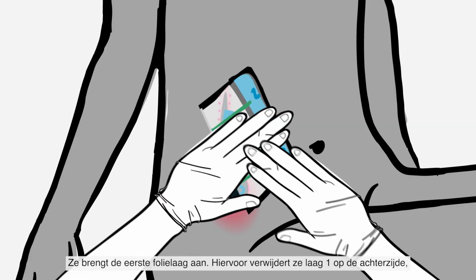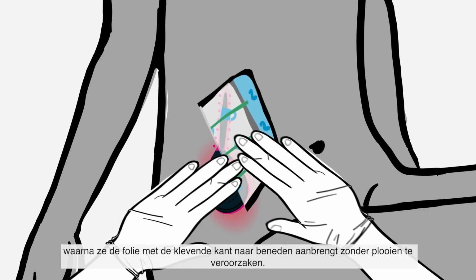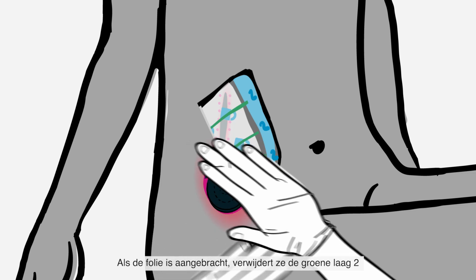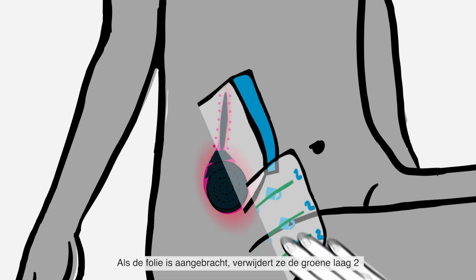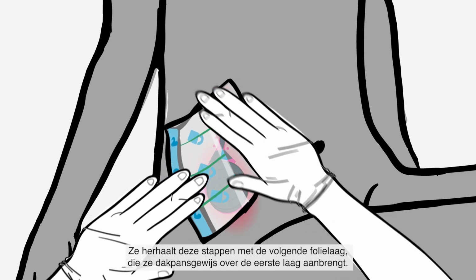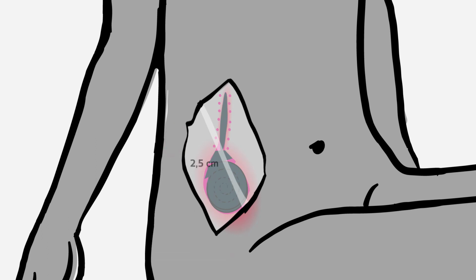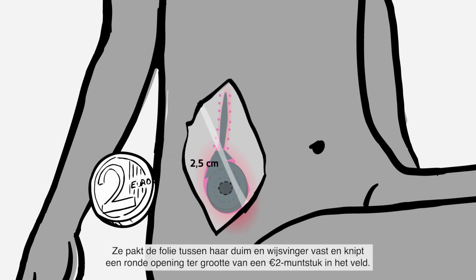She applies the first drape, peeling back layer 1, and places it adhesive side down, avoiding folds. Once fixed in position, she removes the green strip on layer 2 and the blue handling tabs. She repeats these steps with the second drape, overlapping the drape with the first drape. She pinches the drape and cuts a circular opening the size of a €2 or 10p coin in the field.